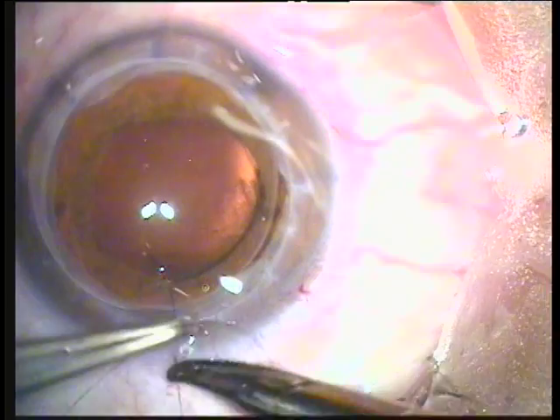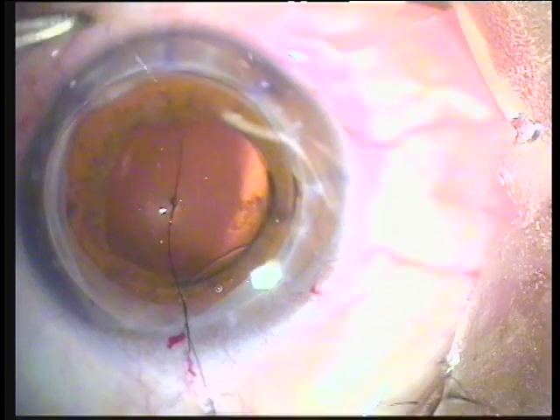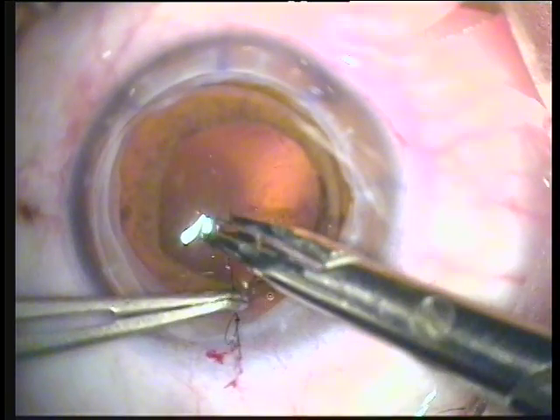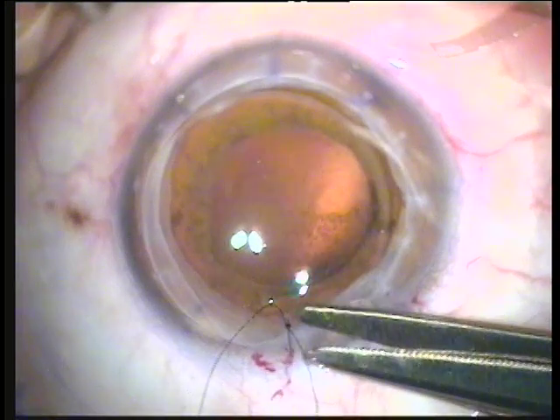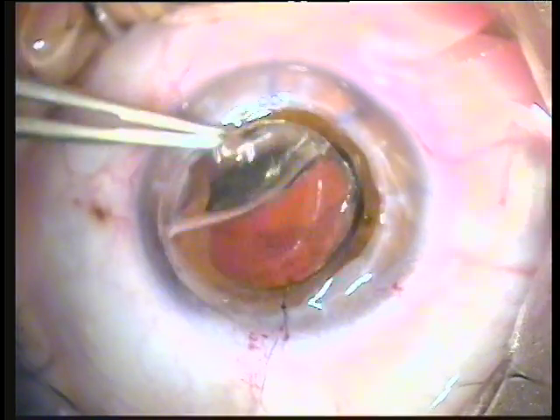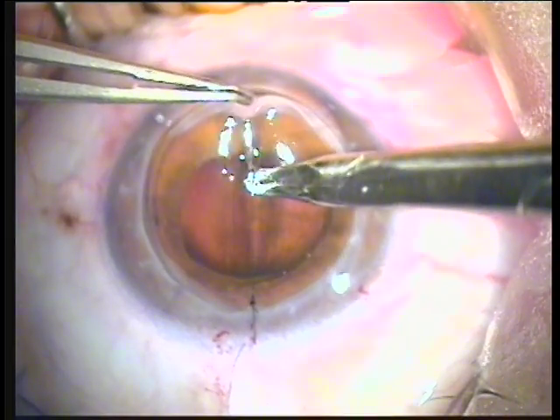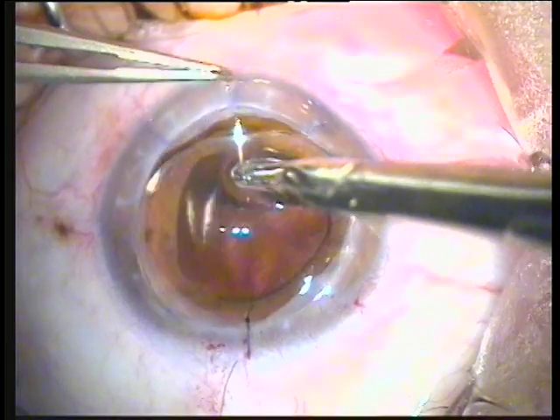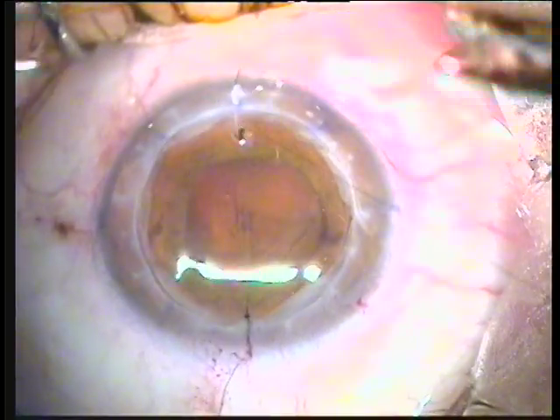The first knot will be locked into place — again, all knots square — and following trimming of the knots, they will be buried within the stromal bed to minimize patient discomfort and irritation. I prefer using Westcott scissors to trim the sutures as this poses less injury. Now the most important suture in a penetrating keratoplasty: the second suture. It needs to bisect the cornea, again slightly over Descemet's membrane in the graft and in the host as well, going through almost to the limbus.